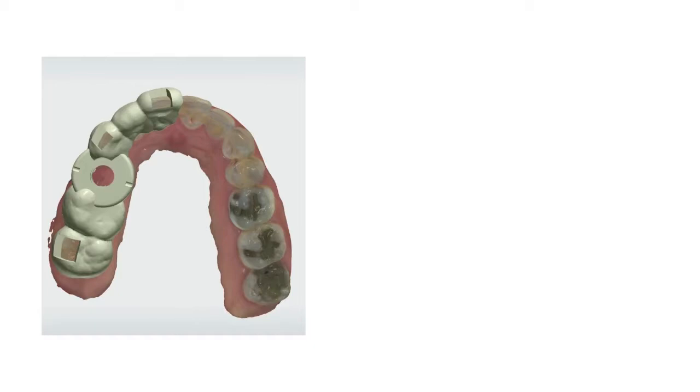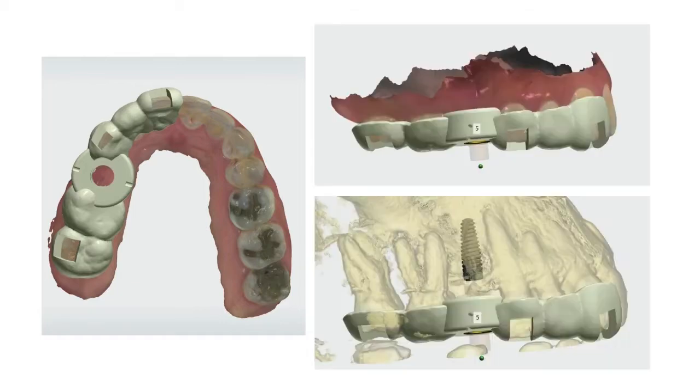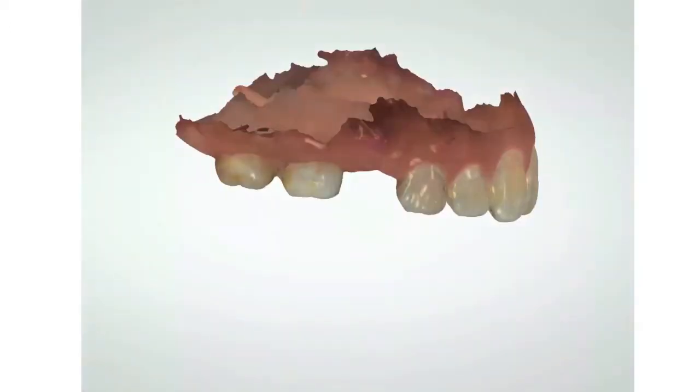At the time of consultation, I get all the additional data, CAT scan as well as intraoral surface scan, in about 3, 4, 5 minutes of additional time. And I don't even do it. My staff goes ahead and does that for me. Okay, so there it is, a surgical guide that's been designed on the same data set.